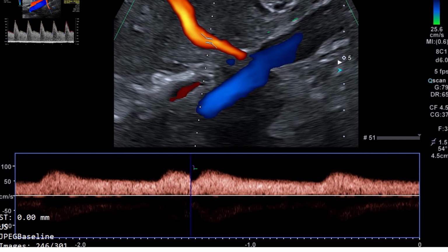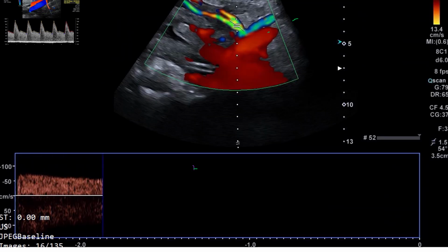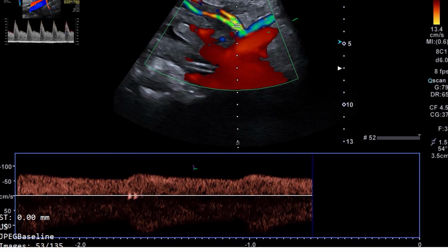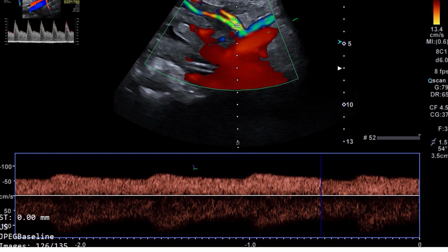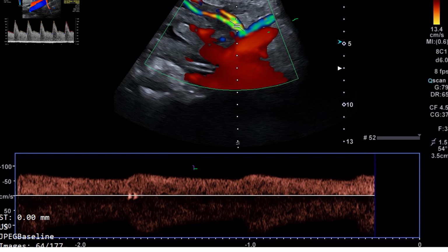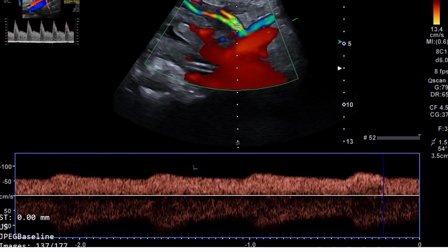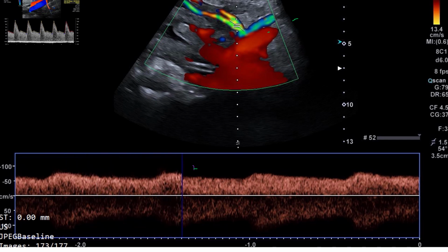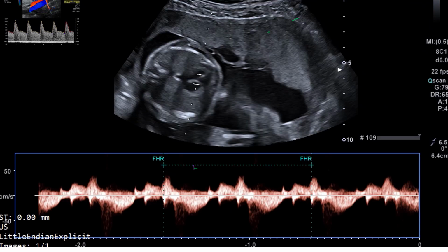These waveforms speak volumes when it comes to fetal management, preeclampsia screening, placental insufficiency, IUGR assessment, and placental abruption also. These things sound as if they are just waveforms for the sake of it. But this is how lives are saved.